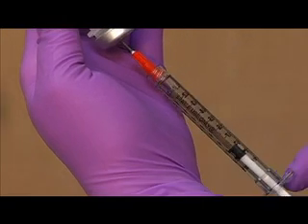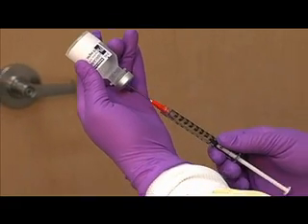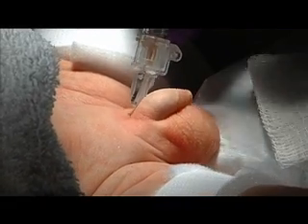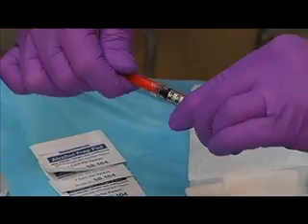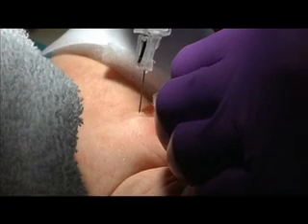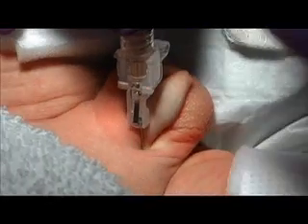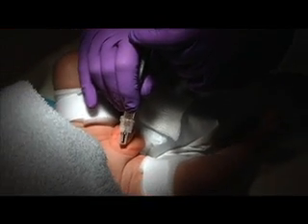Regional analgesia limits the pain reduction to the surgical site and may prevent occurrence of the side effects of general anesthesia. Nerve blocks of either the dorsal penile nerve or the subcutaneous ring have been shown to provide better pain control than topical anesthetics. The dorsal nerve block is performed with the use of a 30-gauge needle attached to a 1 milliliter syringe. Inject 0.4 milliliters of 1% lidocaine without epinephrine at the 2 o'clock and 10 o'clock positions at the base of the penis in a posteromedial direction and to a depth of 0.3 to 0.5 centimeters beneath the skin surface. Allow 5 minutes for anesthetic effect.